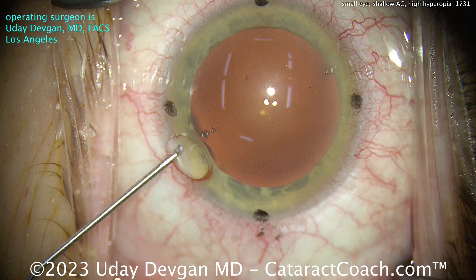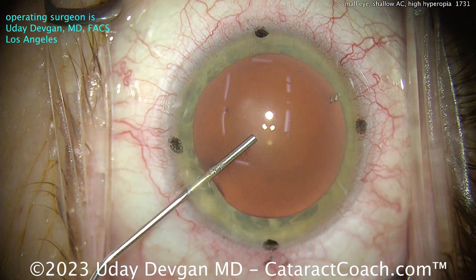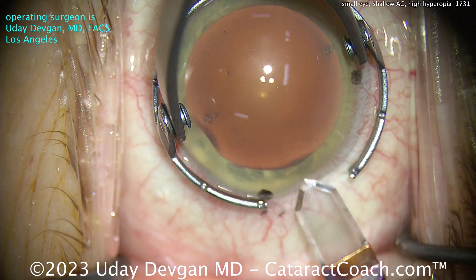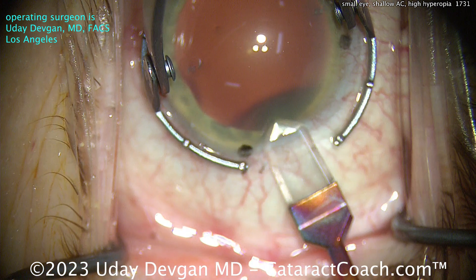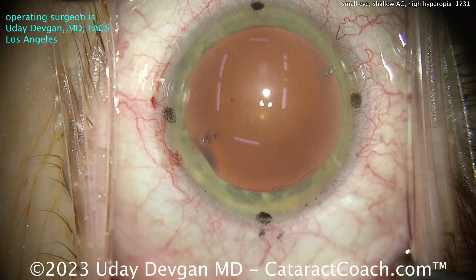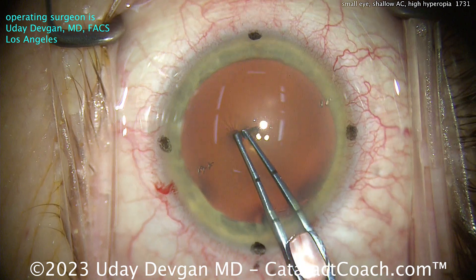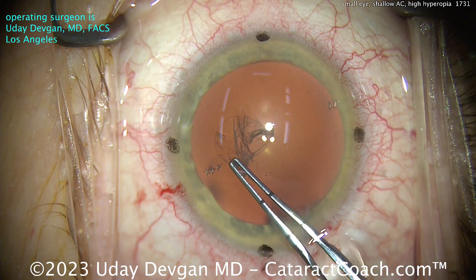We've made a paracentesis. The marks on the cornea right above it indicate the steep axis of astigmatism for this patient. It's a very tiny eye with a high degree of hyperopia. We're making the phaco incision about 90 degrees away from that steep axis, and this slightly wider phaco incision is being taken into account as a 2.75mm incision for the toricity calculations. With a small corneal diameter like this, we're not sure how an LRI would work, so in this case I'd rather do a toric version of a monofocal lens.